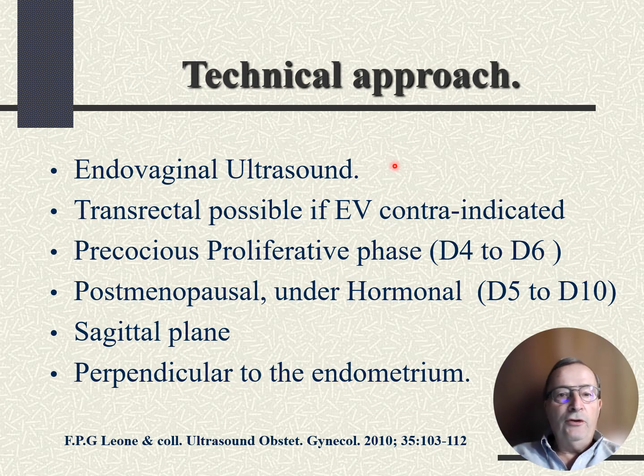We will mainly use the endovaginal ultrasound. In case of contraindication, we can use the transrectal approach. The ultrasound will be performed during the proliferative phase between day 4 to 6, and we will use a sagittal plane, ensuring that we are really perpendicular to the endometrium.